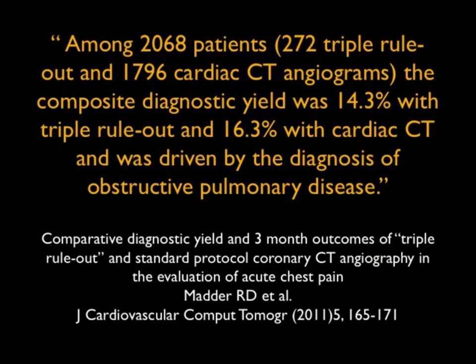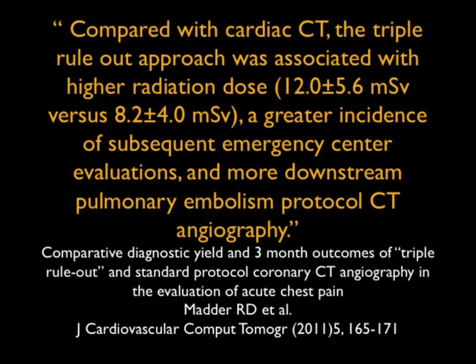The article by Matter did make the point about some of the challenges of triple rule-outs. They were not quite as positive in terms of its usefulness. Compared with cardiac CT, the triple rule-out was associated with higher dose, greater incidence of subsequent emergency center evaluations, and more downstream PE protocol CT angiography.